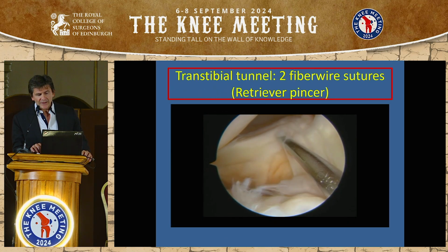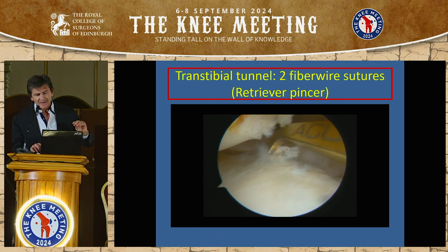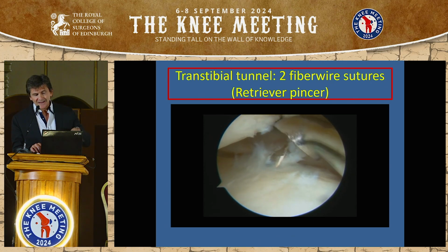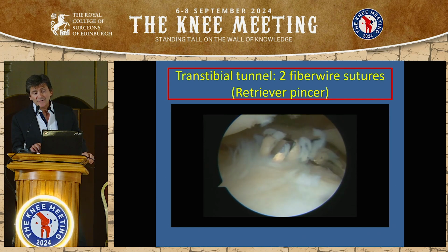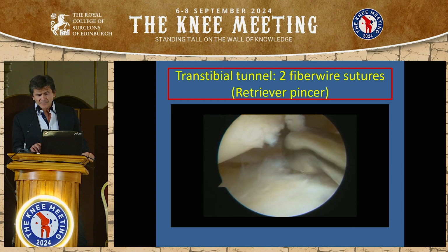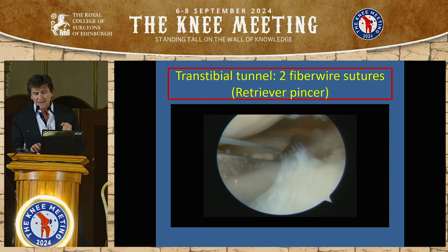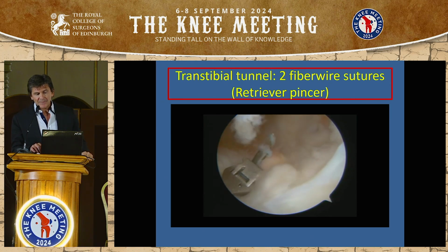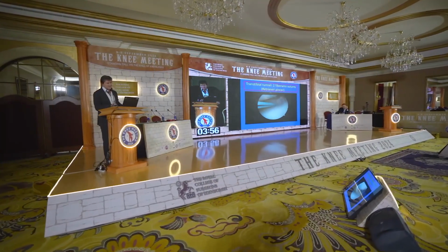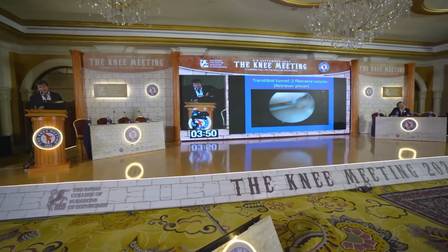This is a small video. You should always have a systematic technique. So first of all, the tibial guide. Second, you create the debridement in the cartilage. I use the 4.5 drill, the one that you use for the button. And then I make a laceration in the cartilage in order to heal the meniscus to the bone. After that, I pass the suture with the Scorpion. I do a sliding knot. I use the first one to pull the meniscus, and then I can do the second one.